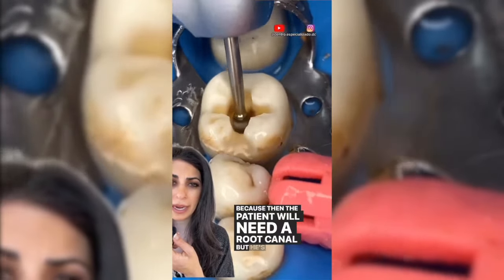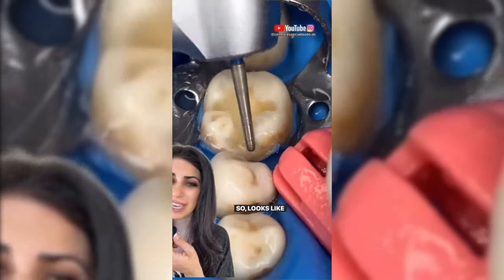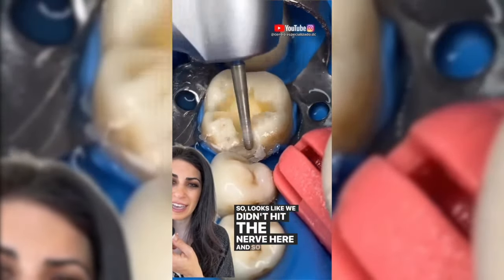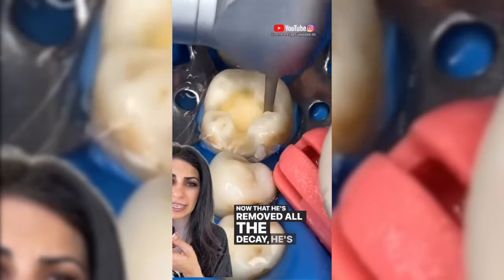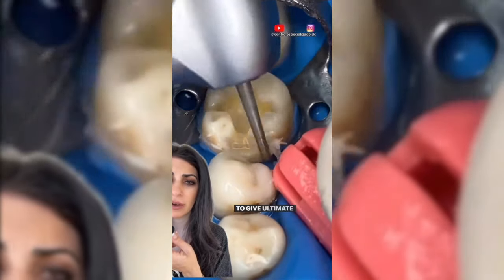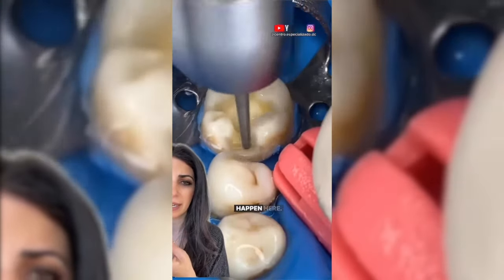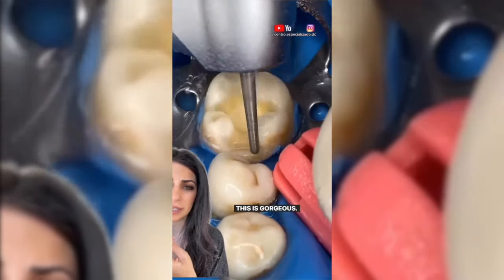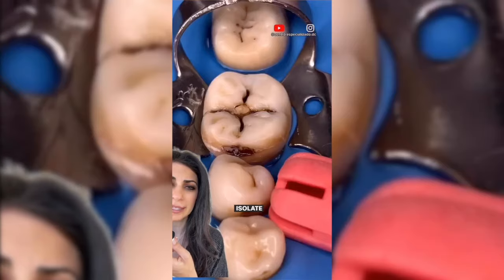He's going in very carefully and he's done a beautiful job — it looks like we didn't hit the nerve. Now that he's removed all the decay, he's refining the prep to give ultimate longevity to the filling. This is gorgeous. Once he's done, he will isolate it and fill it.